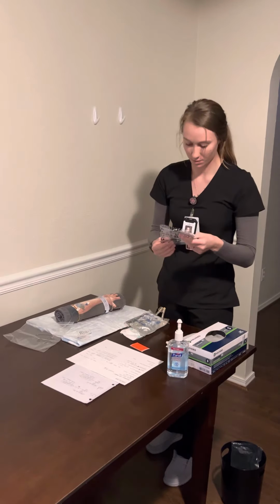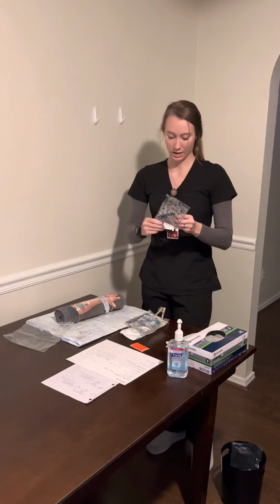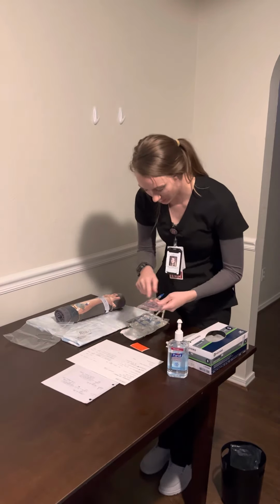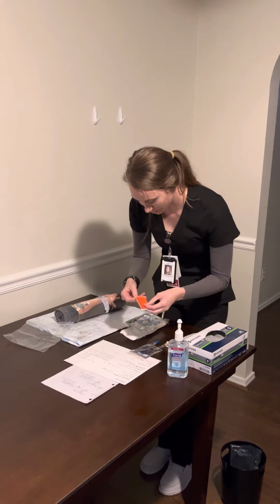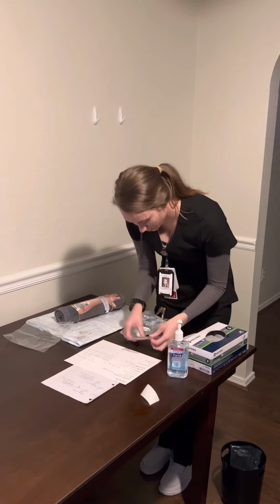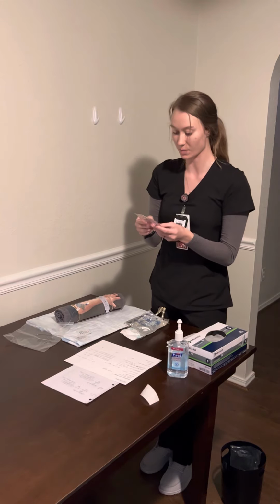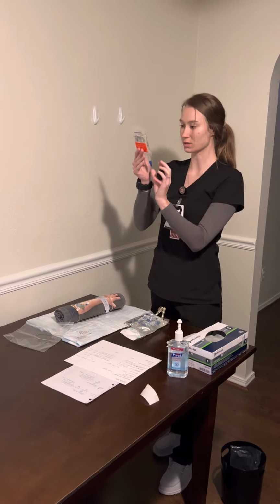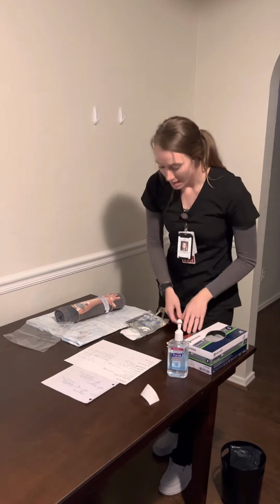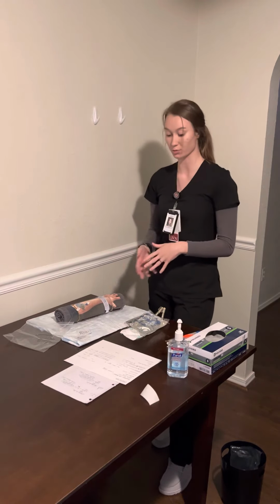And then for my cefazolin, I have cefazolin 1 gram in 50 milliliters, and I'm actually going to label it. The expiration date is 6/20/30, so not expired. Packaging is intact, and I don't see any floaties or particulates. This medication is good to go as well. I've done my 2 checks, and I have all of my supplies. I'm now going to go into my patient's room to administer these fluids.